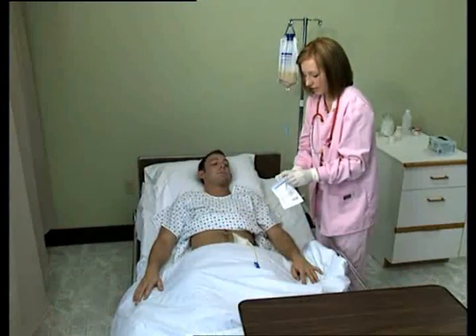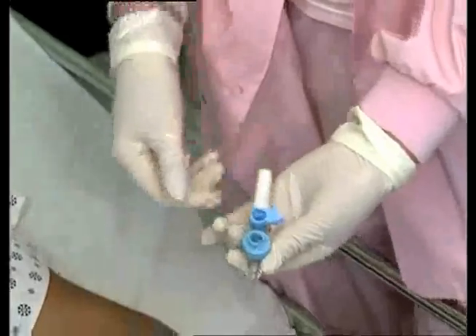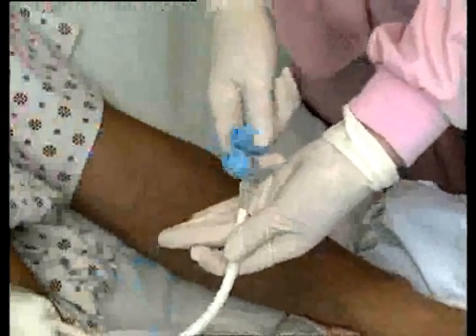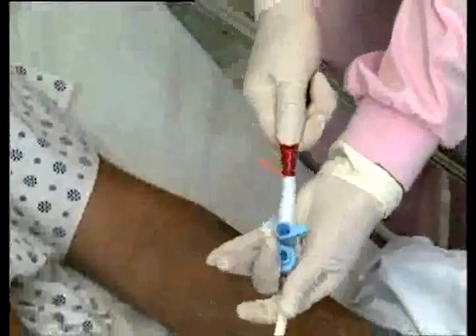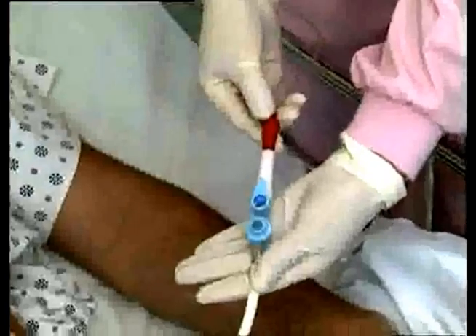Start by removing the Dale ACE Connector from the package. Attach the feeding tube to the catheter connector end of the ACE Connector. Then insert the enteral feeding set or bolus syringe tip into the white flexible adapter. Turn the handle to the on position to deliver feeding formula.